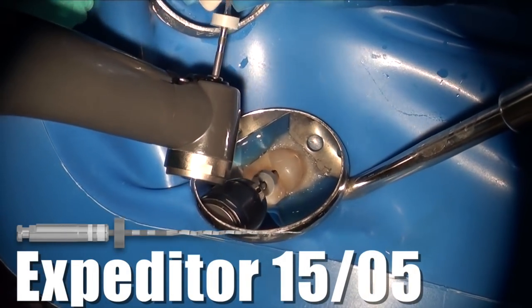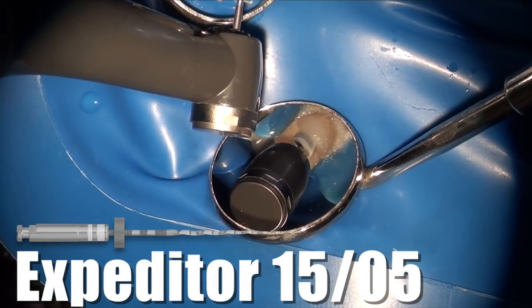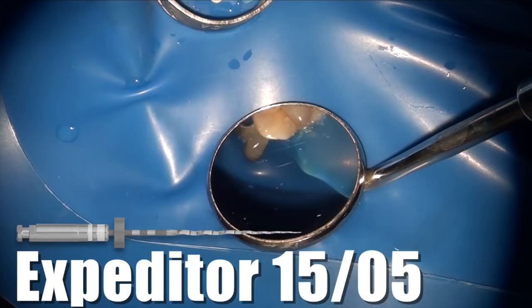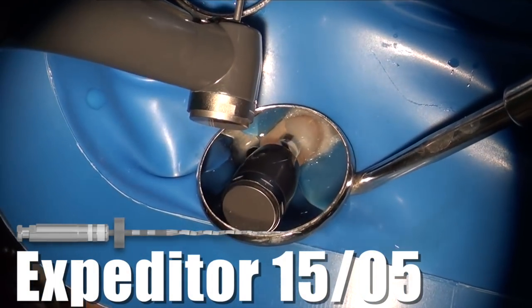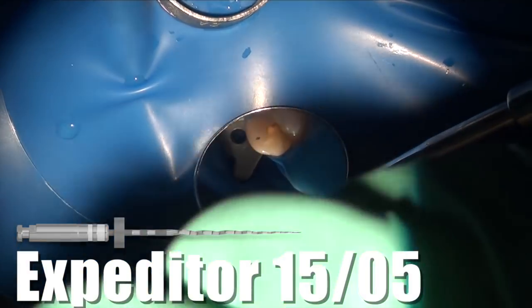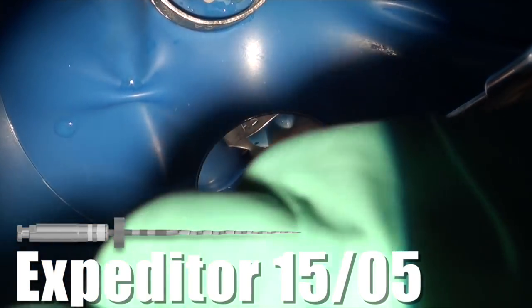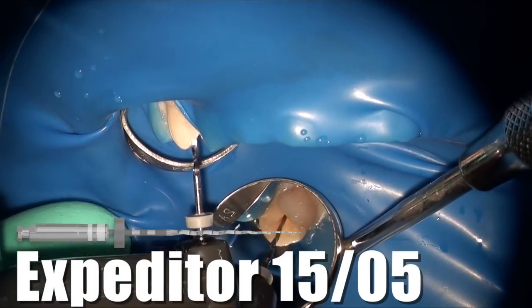Now I'm ready to begin treatment and rotary instrumentation. I'm using the expediter, which is the first file we would use. Ideally you should use a hand file at this point first — use a size 8 or 10 — something that gives you validation of a patent canal. But with more experience, I proceed straight with the expediter. I'm using the rhythm motion here, which is three strokes, followed by removing the file and wiping it.